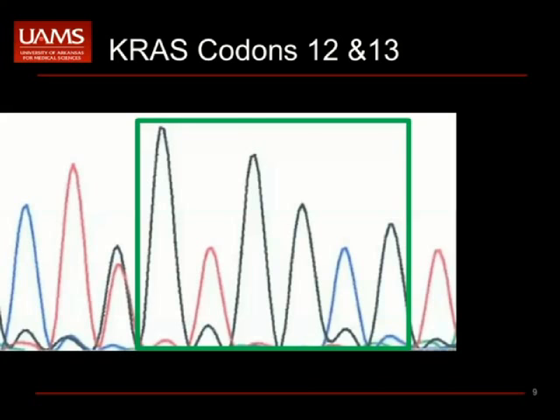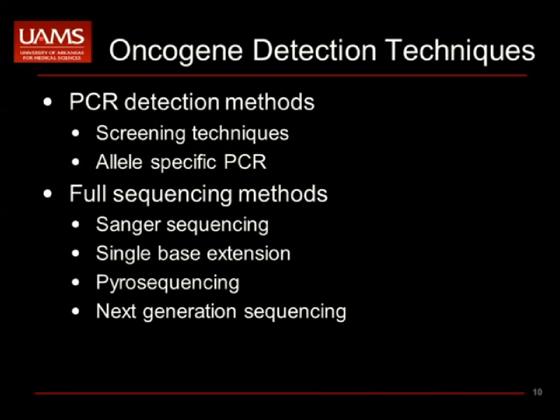And in those cases, you're looking at something like Sanger sequencing or even next generation sequencing to take it to the next step. I will say, since Dr. Dietrich's no longer here, that I am not as optimistic as he is that next generation sequencing will replace what we do today. I think it's worth learning the basics and fundamentals, because I think you'll be using them for quite a number of years.